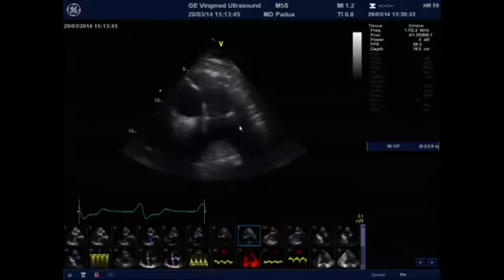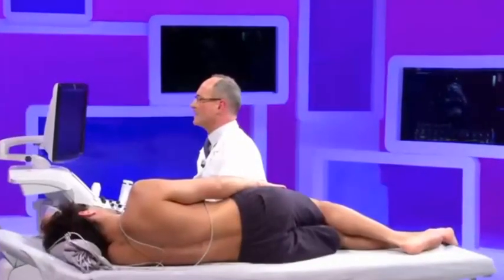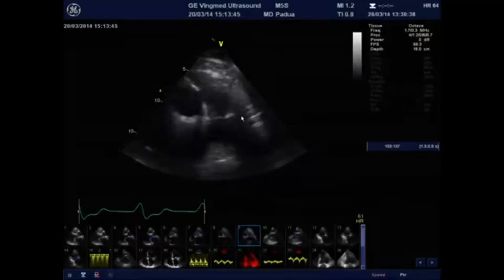This is a quite rare complication, but it may occur, and the first examination immediately after heart transplant should look at the suture at the pulmonary artery as well as those to the aorta.